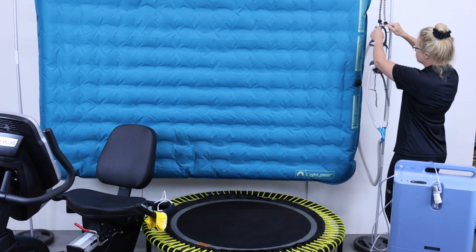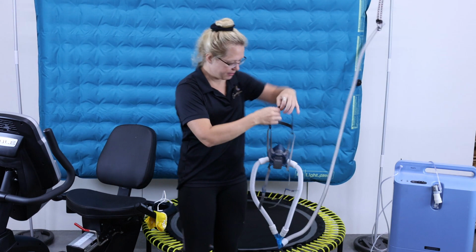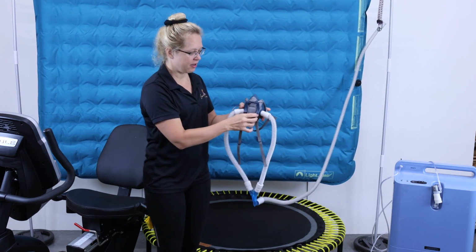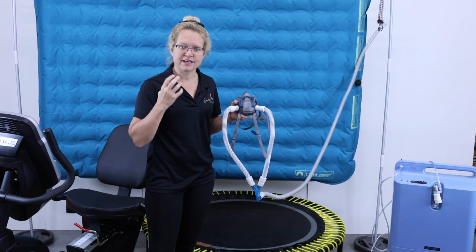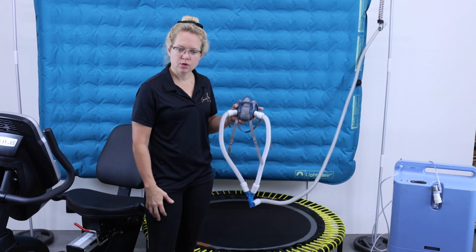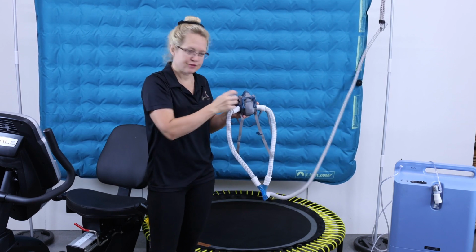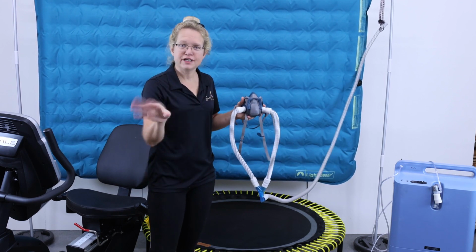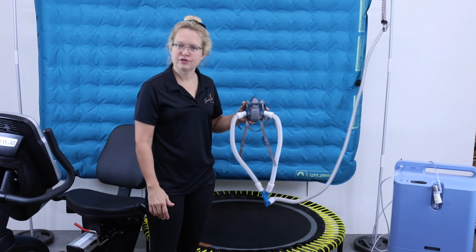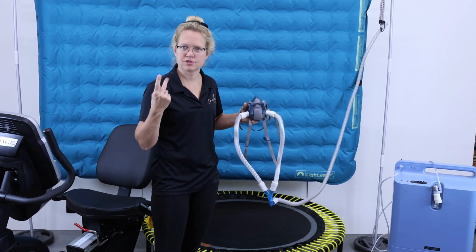So when you're ready to exercise, you have to don your mask. Let me talk about the mask for a little while. This mask right here I made, and it's just a 3M filter mask that you would use if you were painting or using a chemical. You can buy them at Home Depot and Lowe's, and then you buy cartridges that click onto the side. You do a little half turn and they click on. You don't need the cartridges in this case, you just need the mask. The mask is usually around $22.